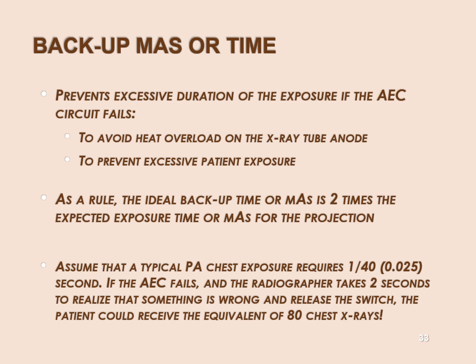The point of a backup timer is, if the AEC never counts radiation at the ion chamber because your patient's too thick, your exposure will just keep going and going and going until you let off the button or you blow up the tube with heat. Okay? And if you're doing that, are you overdosing your patient? You bet your butt you're overdosing your patient.